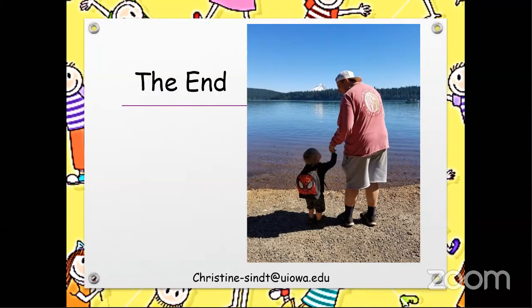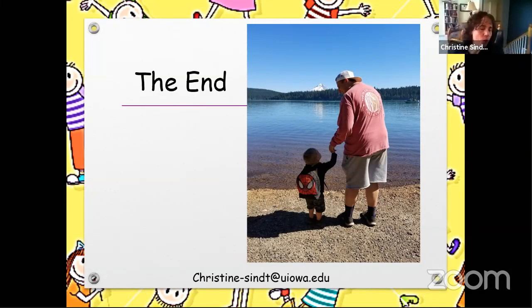How exactly do you recommend we manage the corneal asymmetry with Stevens-Johnson syndrome without cutting them? So is the goal corneal protection, or is the goal vision, or comfort? You really have to establish the goal. By far the easiest way to do it is to get some type of 3D image of the eye. Even if you don't have access to that, you probably are going to have to put on a soft contact lens to go up and over it.